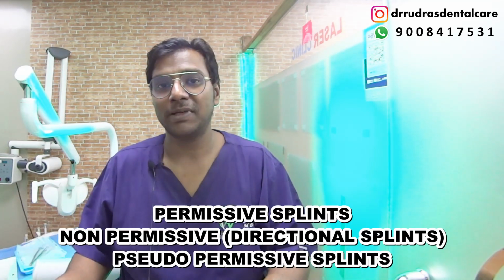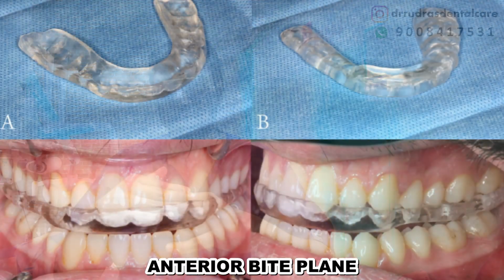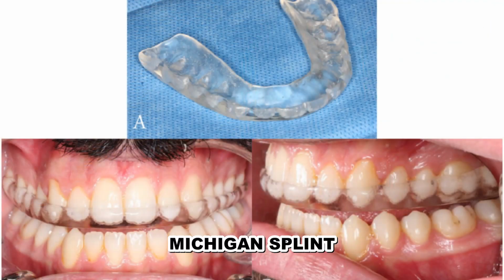Now, coming to a broad categorization of splints, you have permissive splints, you have non-permissive splints, and you have pseudo-permissive splints. Now, permissive splints are basically the splints that help in disoccluding some of the teeth or all of your teeth depending upon the type, so that your condyle goes into the centric position and it's more relaxed. Now, you could either have an anterior appliance where just your incisors meet and the rest of the posteriors do not occlude or bite, or you could have a flat splint, which is known as a Michigan splint, that disoccludes all of your teeth. That means none of your teeth basically meet each other and the jaw joint relaxes.